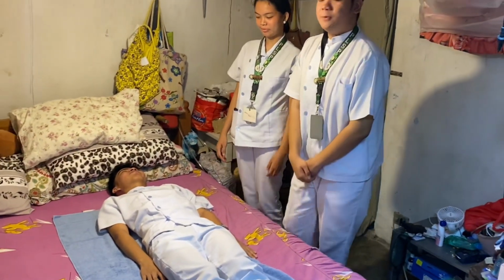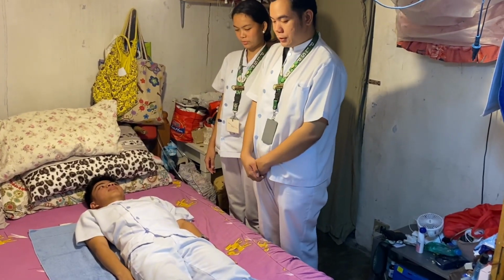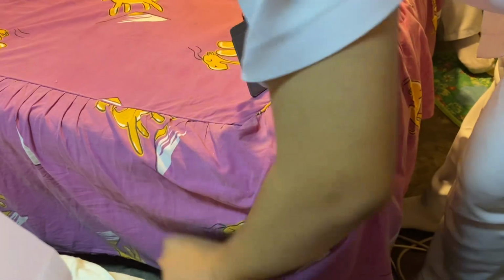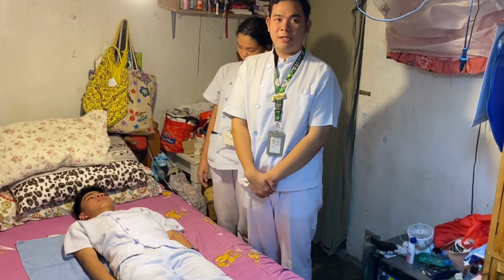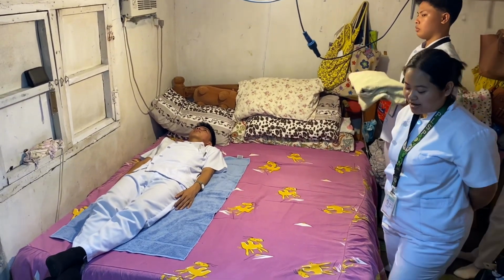Okay, next is we will raise the client's bed higher than the surface of the stretcher, preferably at least half an inch. So let us now assume that the client's bed is now higher than the surface of the stretcher, that is at least half an inch. Now we're going to ensure that the wheels of the bed are locked.